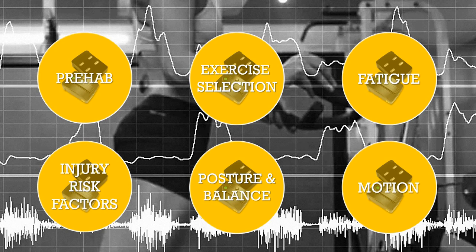So we can assess our kinetics, our force element of motion, using the isokinetic dynamometer, force plate. There are a couple of other techniques which we'll come to learn about as we progress through the course, but those forces then produce movement, which we can assess with our camera system, whether it be 2D or 3D.